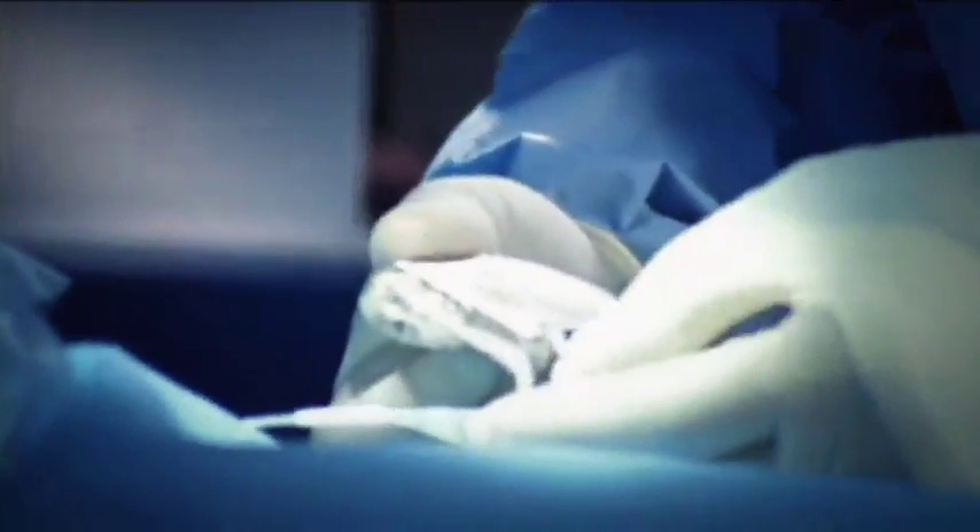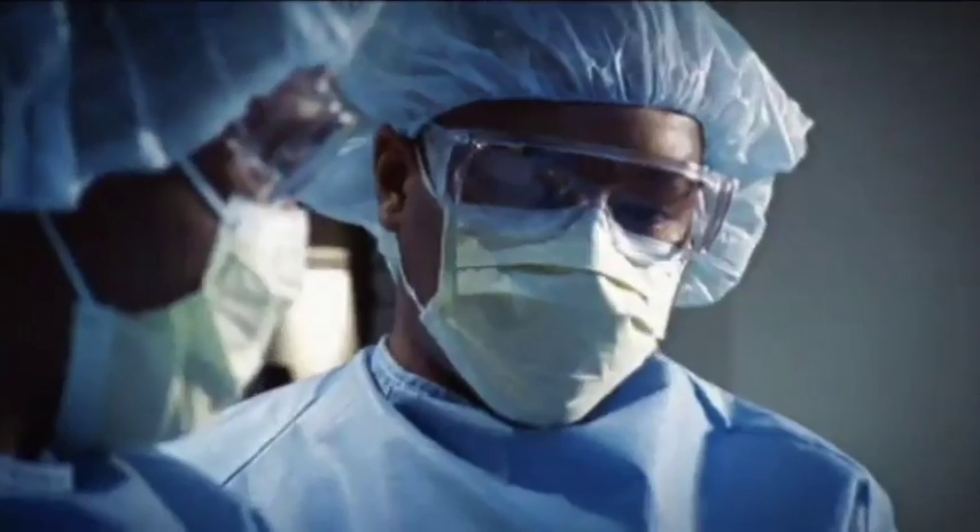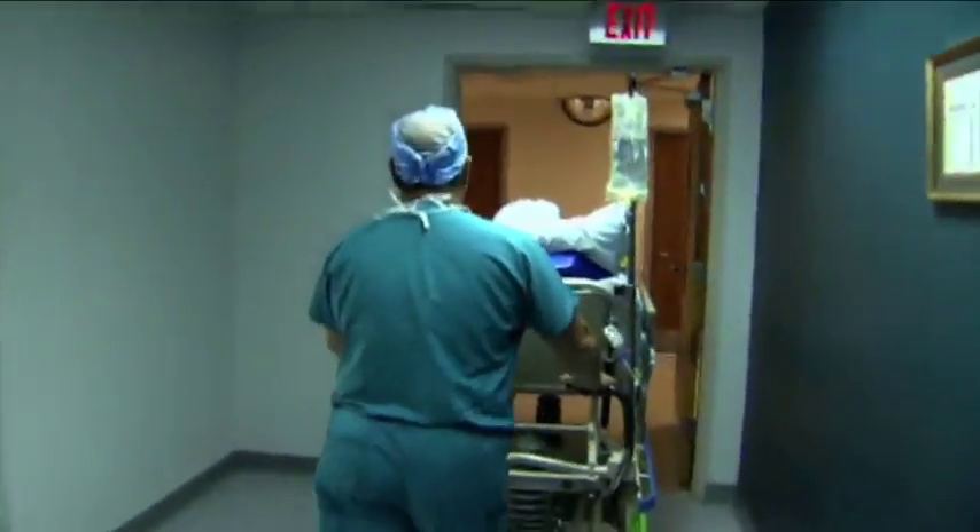Typically, the implant procedure is done under local anesthesia. It does not require open-heart surgery, and most people go home within 24 hours.